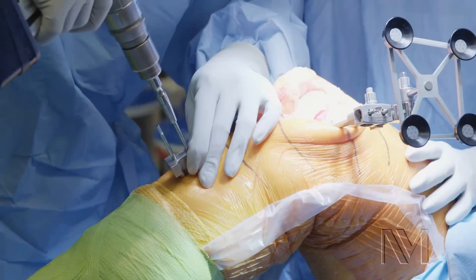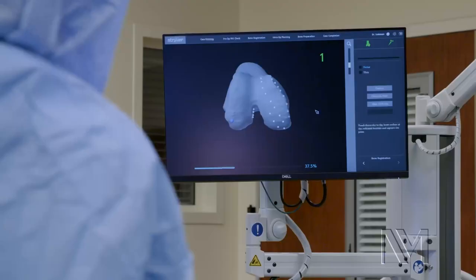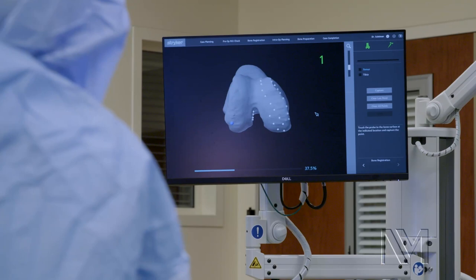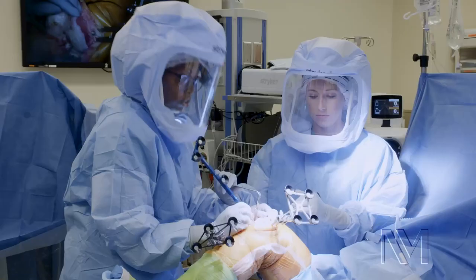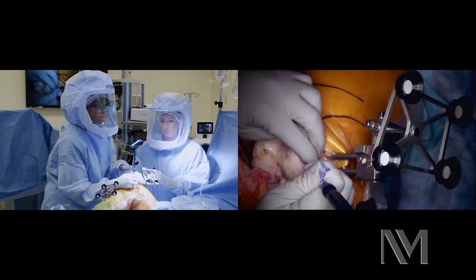Now what I'm trying to do is what's called mapping of the bone. I'm trying to match the bone to what we see on the CT scan. No two patients have the same type of arthritis, so it really customizes and personalizes surgery for our patients. Ultimately, all this information that we're inputting into the robot is going to register to the saw blade.